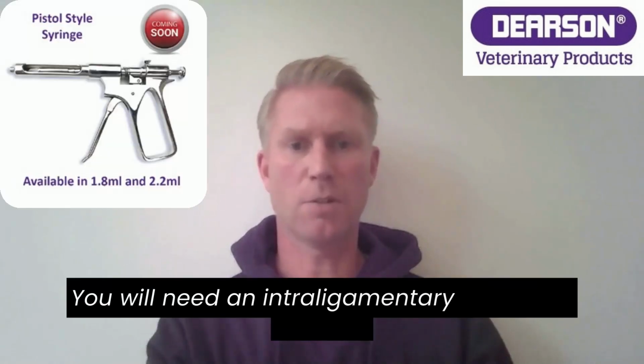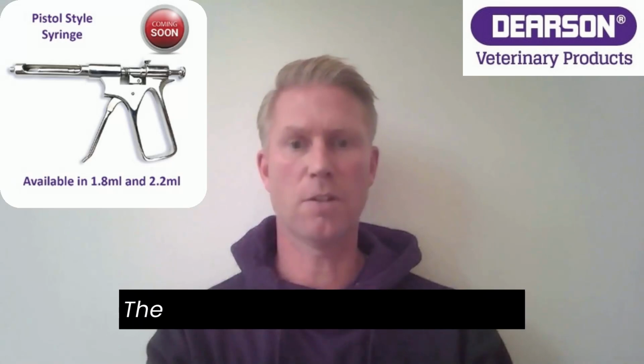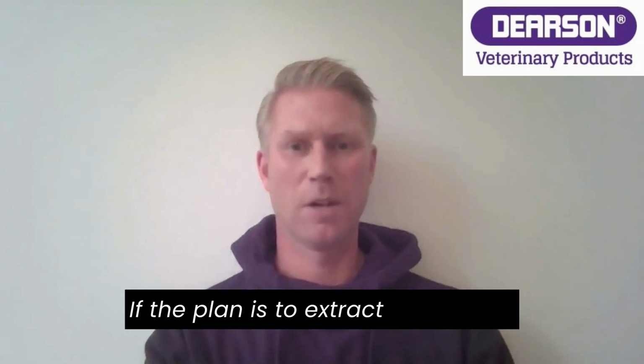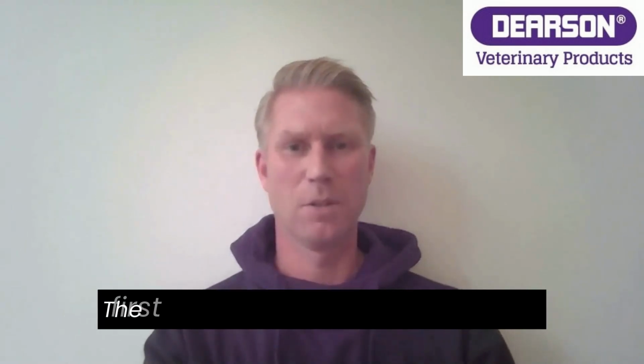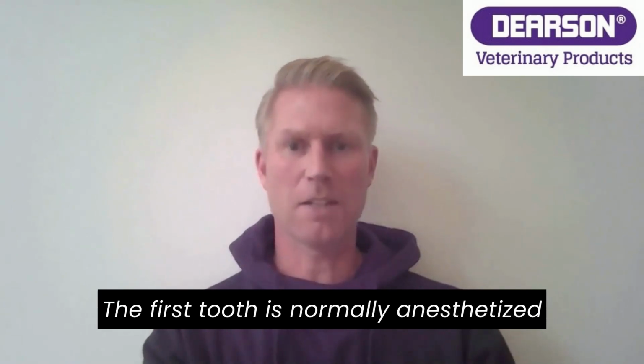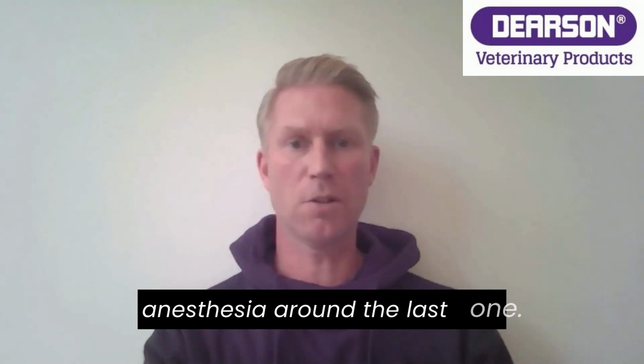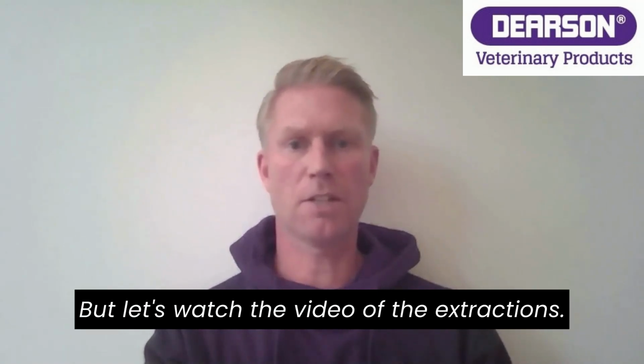You will need an intraligamentary pistol and needles for the pistol. The needle must be advanced into the alveoli and in the gingiva around the tooth. If the plan is to extract all incisors, the first tooth is normally anesthetized when you have done the intraligamentary anesthesia around the last one. But let's watch the video of the extractions.